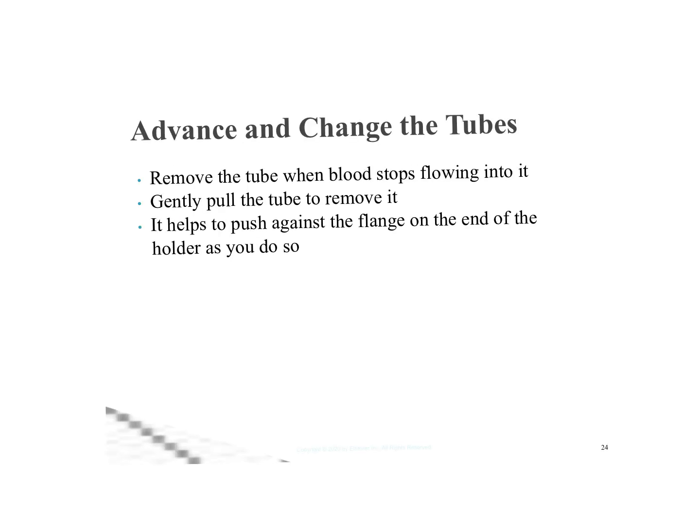Remove the tube when blood stops flowing into it. Gently pull the tube to remove it. Again, it helps to push against the flange on the end of the holder as you do so.